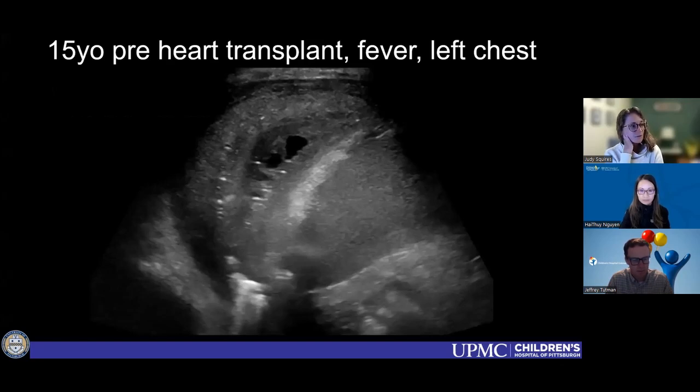This was a 15-year-old pre-heart transplant patient. And I'm never going to forget this case because the heart transplant surgeon said, if this is pneumonia, he does not get a heart.